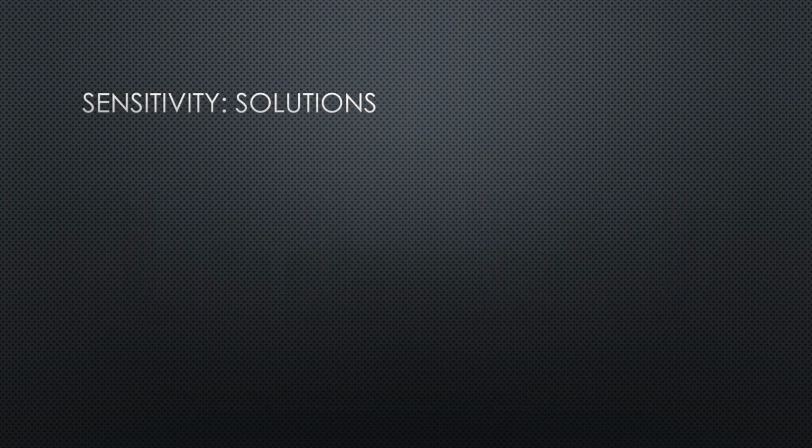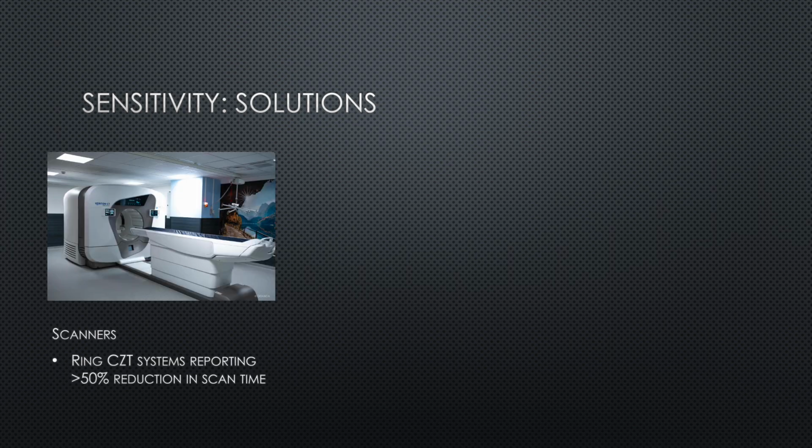So what solutions have we got in terms of sensitivity? Well, one is these novel SPECT scanners that I mentioned right at the outset, where with ring CZT systems, there's been reported to be able to reduce the scan time by 50% or more.